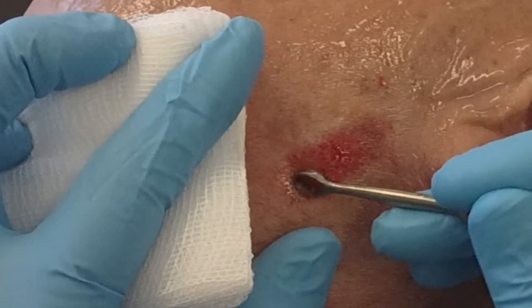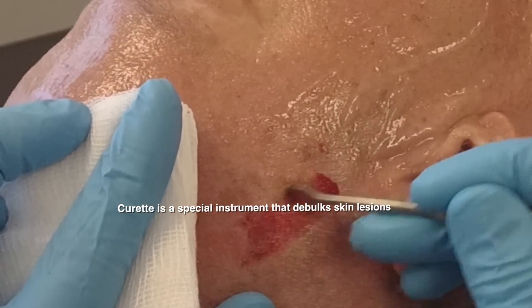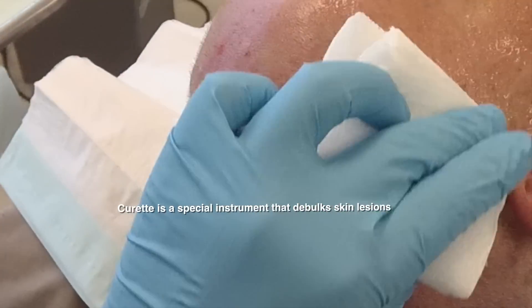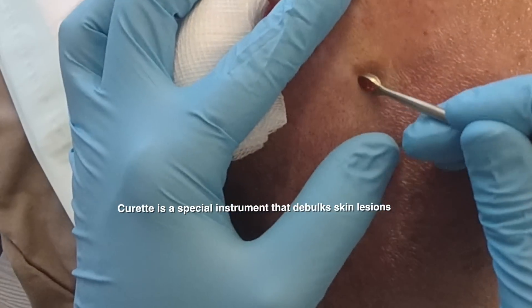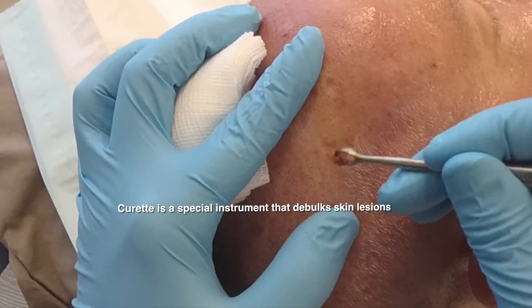Age warts are really common. They can occur on the face and also on other areas such as the scalp and on the body as well. This patient has an extensive amount of seborrheic keratosis on the scalp. The first thing I do is use a curette. A curette is a special instrument that debulks the skin lesion — it's not a sharp cutting instrument but rather a blunt one. As you can see, it debulks the lesion.